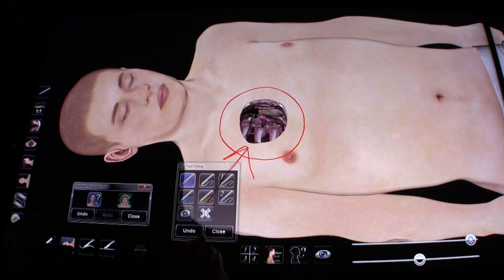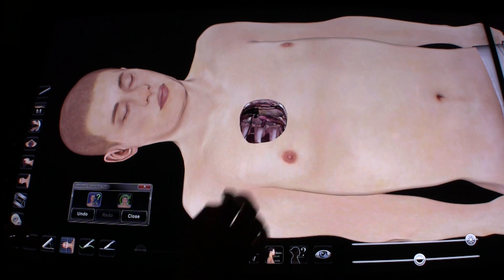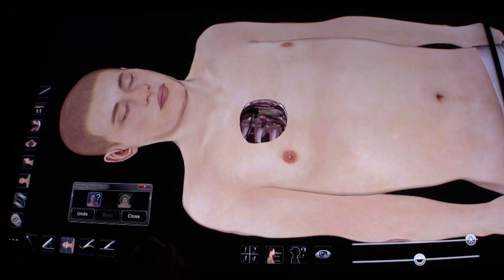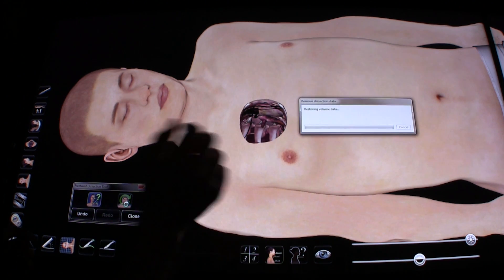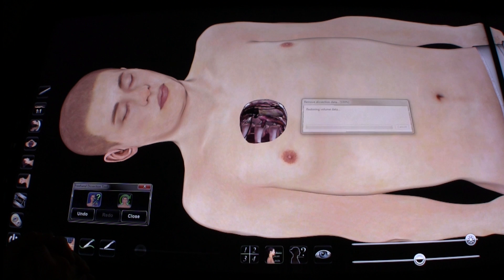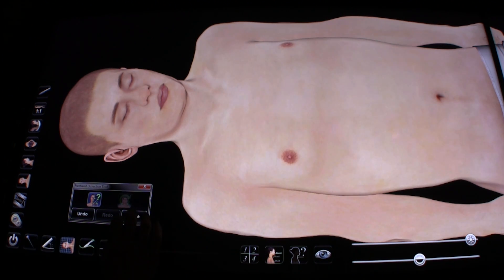Let me undo everything I've done here. The X button clears my drawings, and the green arrow removes the dissection.